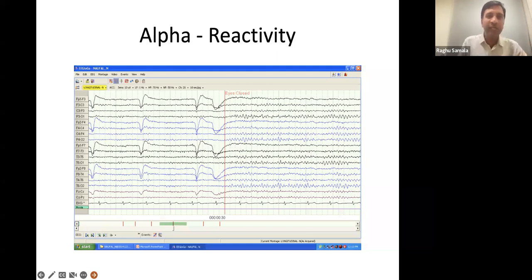So what we have learned till now is that EEG is to record the electrical activity from the brain. Our electrical activity resembles the AC current, and AC current is like sine waveforms. After knowing this, we know what we record in the EEG is normal and abnormal activity.